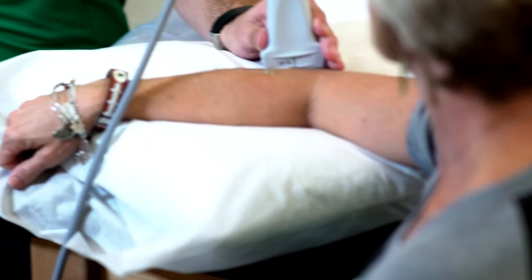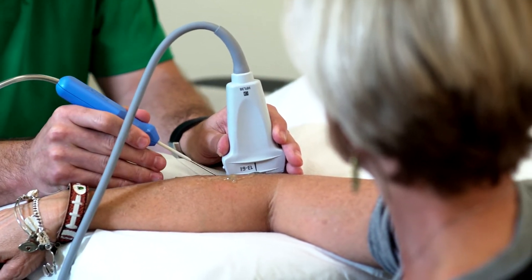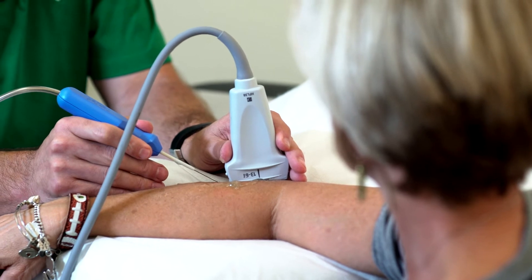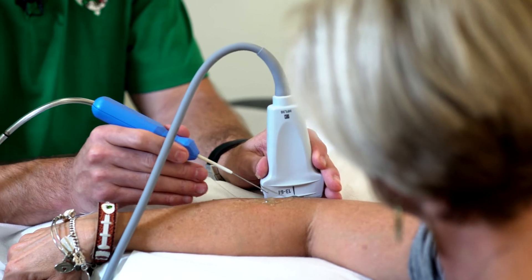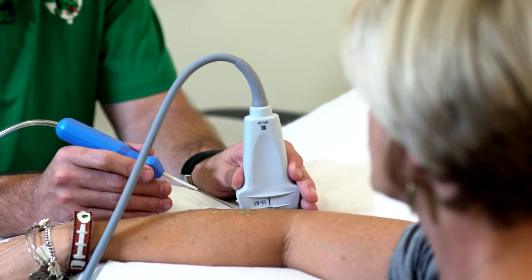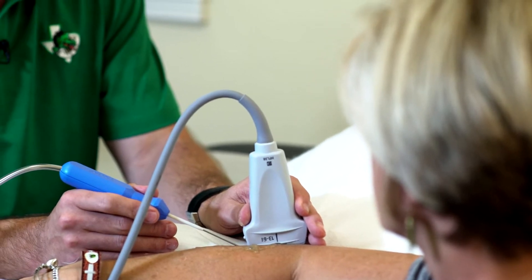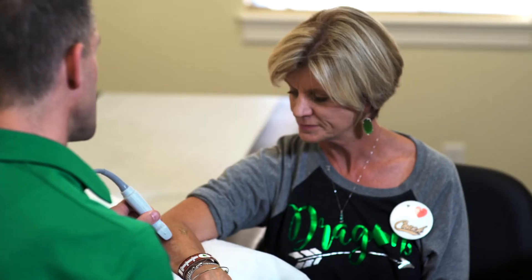When I did the procedure, I held the ultrasound machine in one hand. In the OR setting, I make a small puncture in the skin and drive the TenJet right into the tendon itself, working in and out of the tissue — first going back and forth, then working in a pizza-pie pattern, back and forth, for three minutes. After about three minutes, when the picture looks satisfactory, I remove the TenJet and place a steri-strip over the incision. It's a very simple procedure.